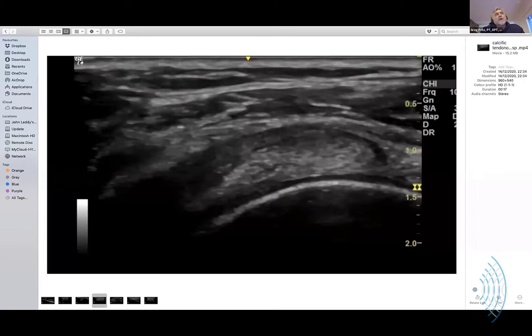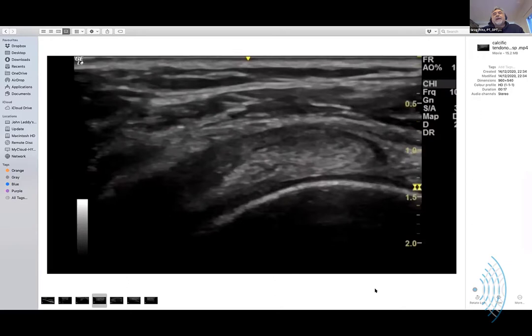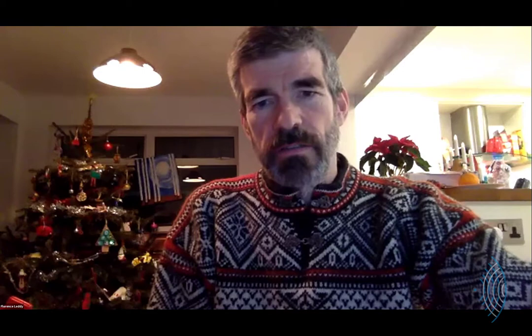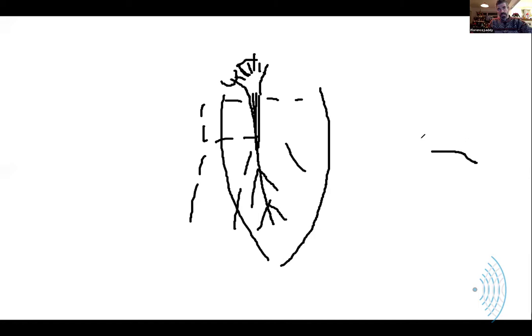You have to re-angle the probe to follow those fibers in. What I want you to draw is a view of the interval, and then demonstrate the way you hold your probe. I think you're putting the top edge of the transducer into the area where we're looking at the slope of the greater tubercle - is that right? Yes, the downslope. If you think of standing on the humeral head and looking down, you can see the tabletop mountain shape.